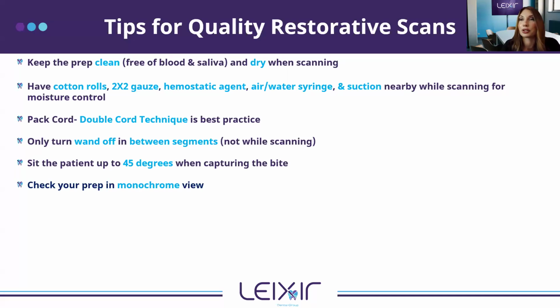We talked about checking your prep in monochrome. So toggling over, I'll show you the tool when we do our live demonstration. Some offices only scan in monochrome and don't even scan in color. If that's what you'd like to do, please do. But you will be able to see your margins much better in monochrome. So always evaluate your scans before you send them in that stone model or monochrome view.